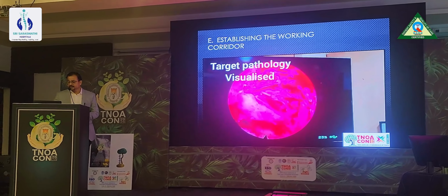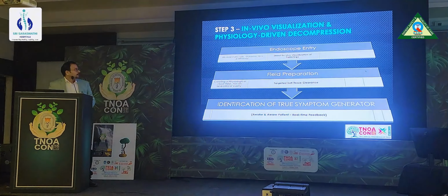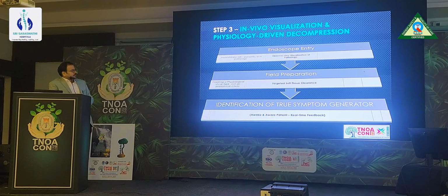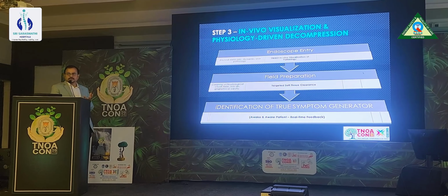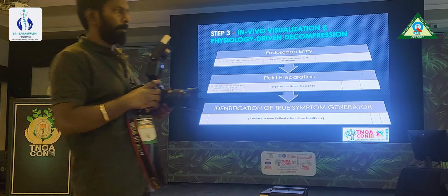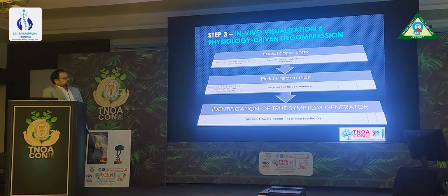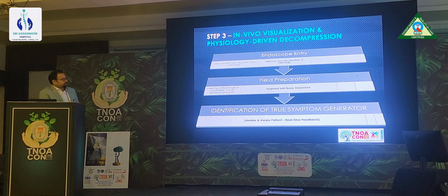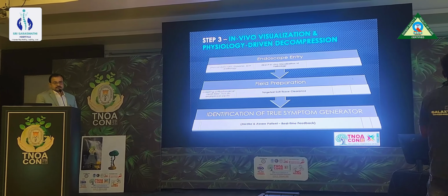Once our target pathology is visualized, now we have to proceed in a controlled and precise manner. So here, in the third step, after endoscopic entry, your static MRI ends and your real in vivo visualization of the pathology begins, and after preparation, we have to do physiologically driven decompression in an awake and aware patient.